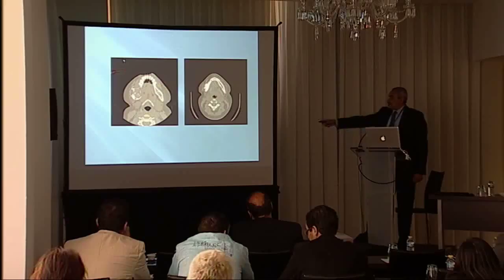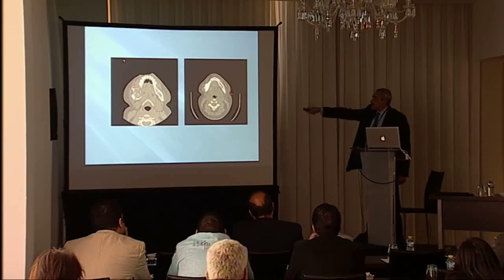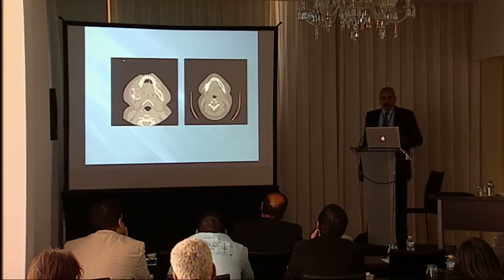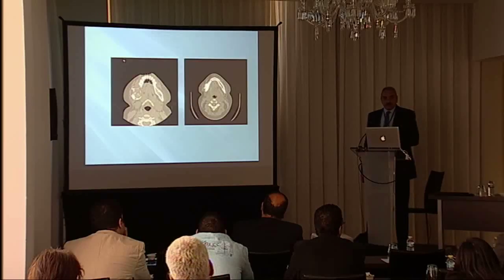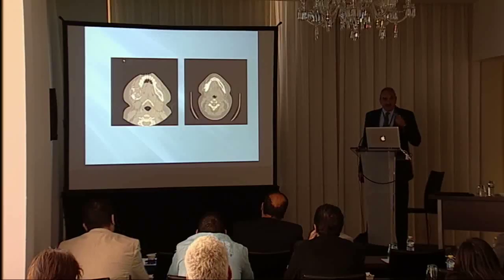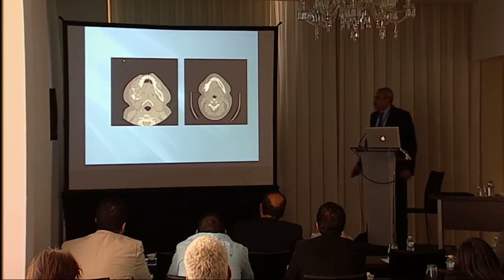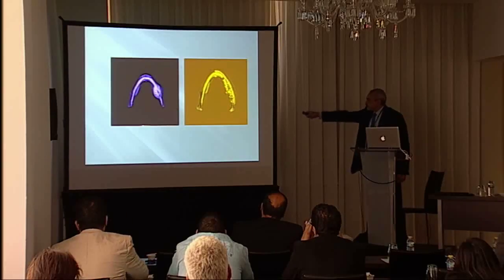But in the post-operative CT scans, as you can see, the mandibular symmetry. And I've done this for years and years. I'm an old guy, without the use of computer guidance. And now with the use of computer guidance, when I look back even at my cases that I was proud of, I can see differences now that I can avoid, and I can give the patient the exact symmetry. And you can see here, this is the mandible, and this is the reconstruction plate.